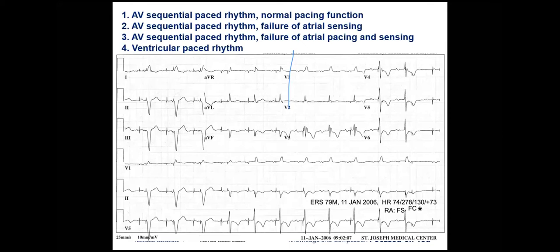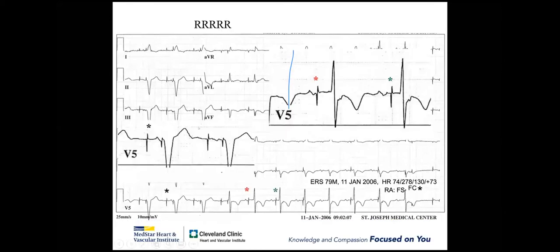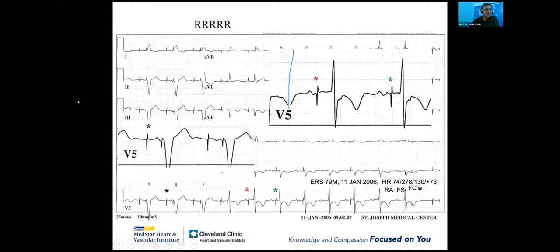And then ventricular pace, atrial activity, and then without pace. So it makes sense that this is probably both sensing and pacing failure of the atrial lead. So this is what I have done. Sir, I'm going to echo. Yes, follow. In the rhythm strip, what we find is initially both atrial and ventricular pacing.